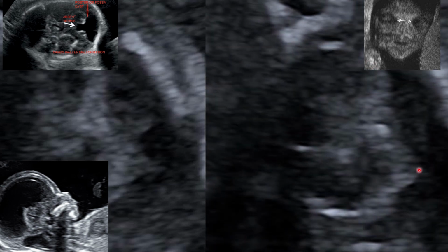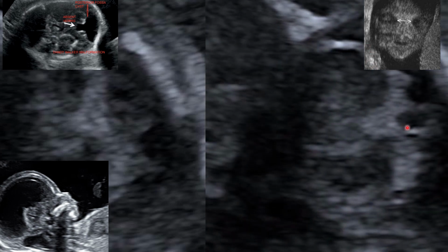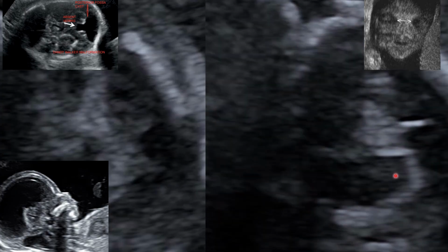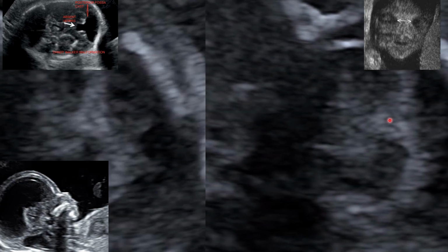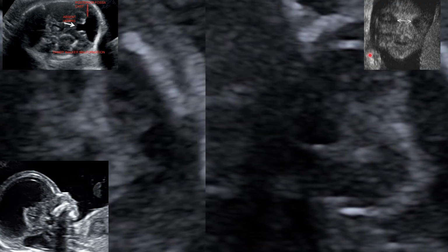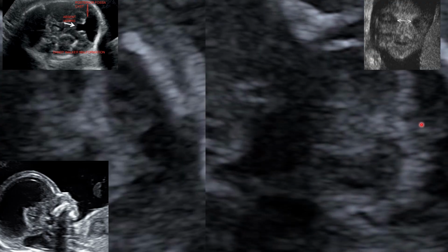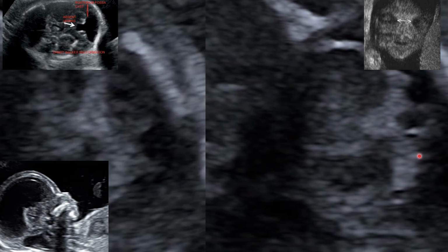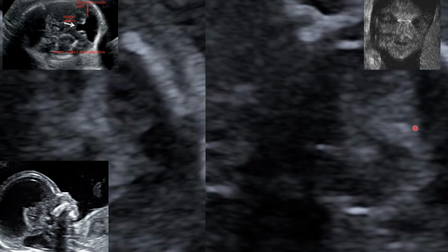So this is a typical second trimester scan where we check for any sign of Walker malformation. The cerebellum and the cisterna magna are a crucial landmark to check for Walker malformation.